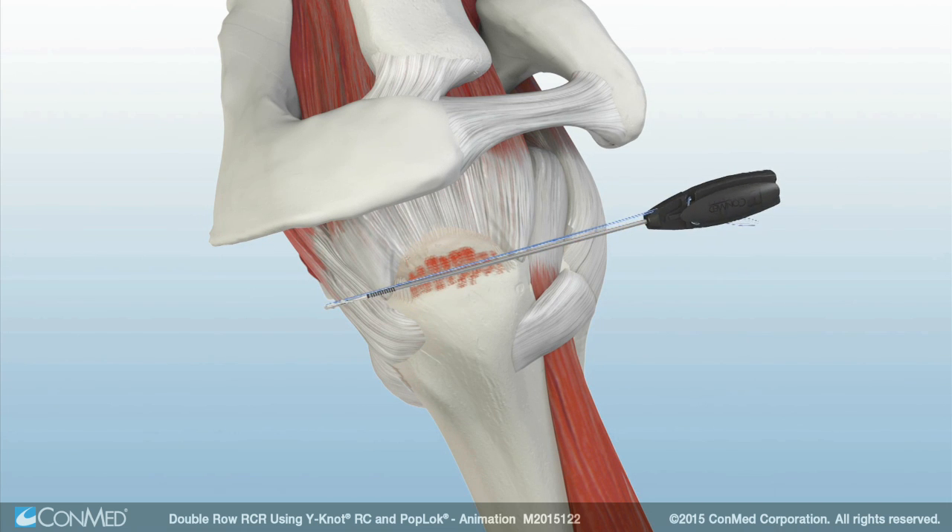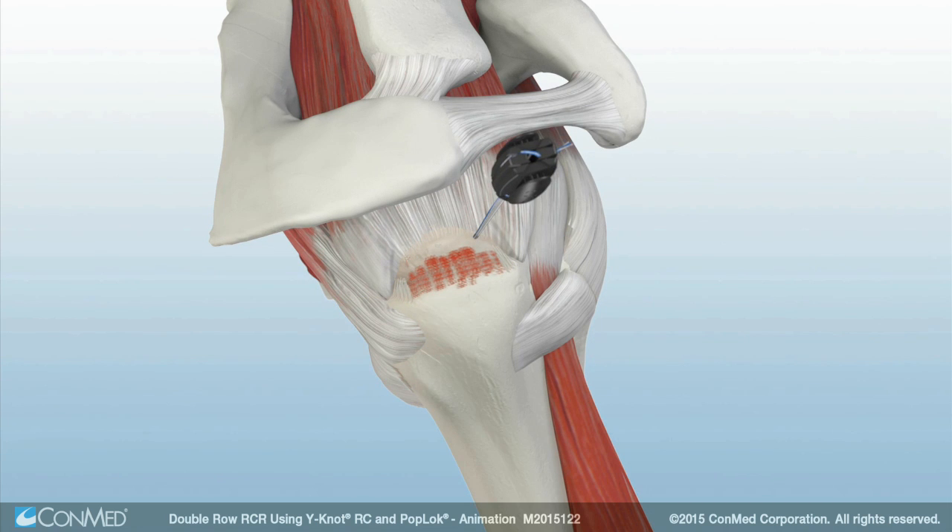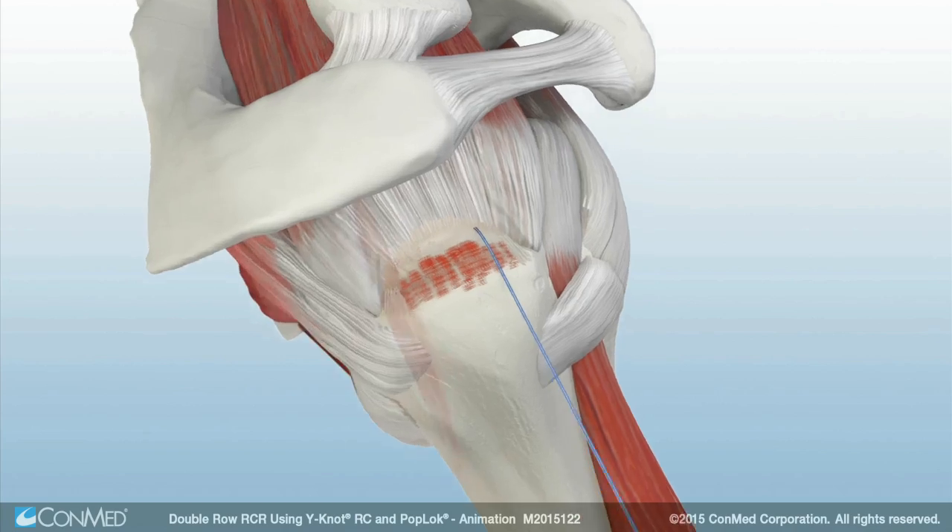A double-loaded Y-Knot RC anchor is inserted past the primary laser line and the inserter is removed. Pull back on all suture strands to set the anchor firmly against the cortex.